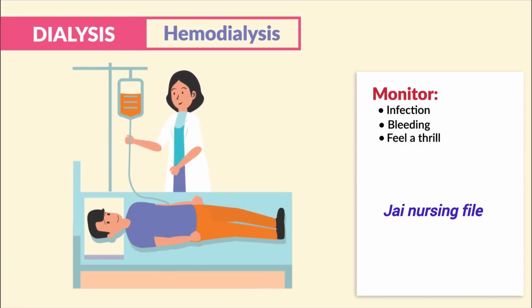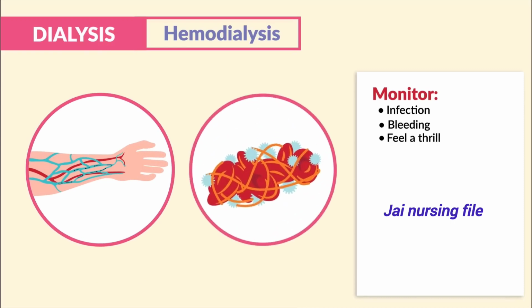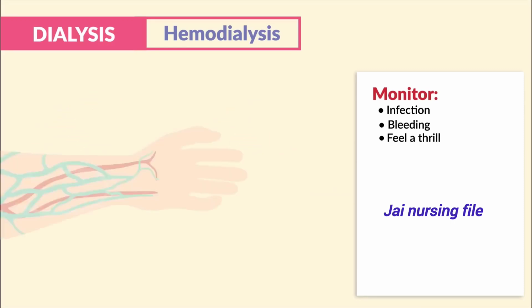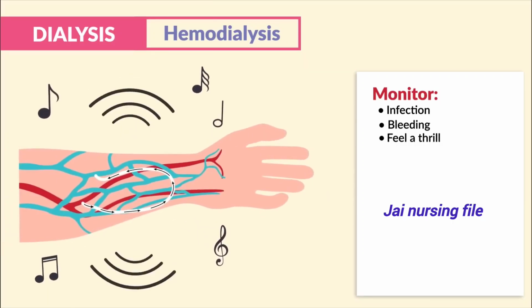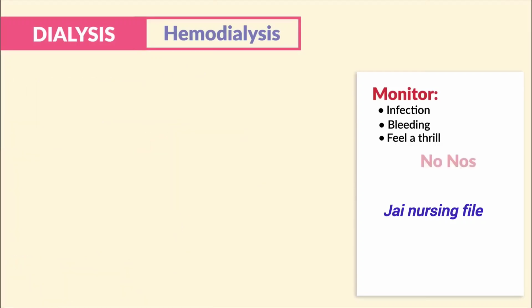That came up a lot on question banks. We're monitoring for the stenosis, basically that stiffening, or even thrombosis, that blood clotting at the site. So just think you have to check for those good vibrations.